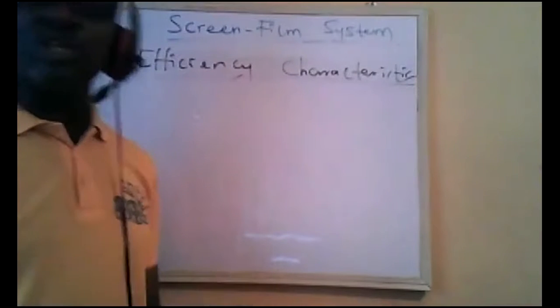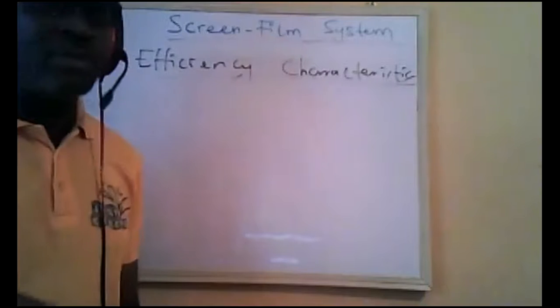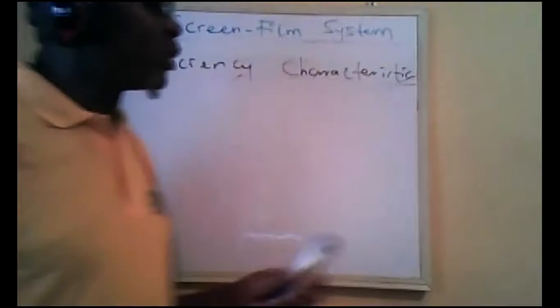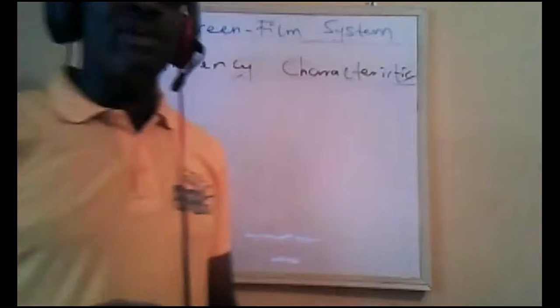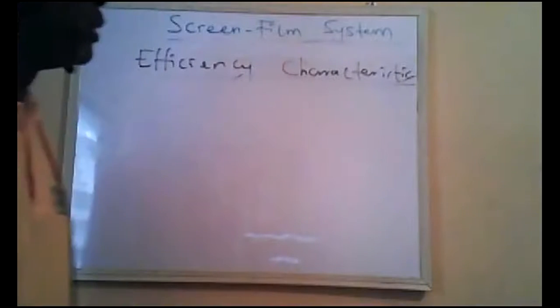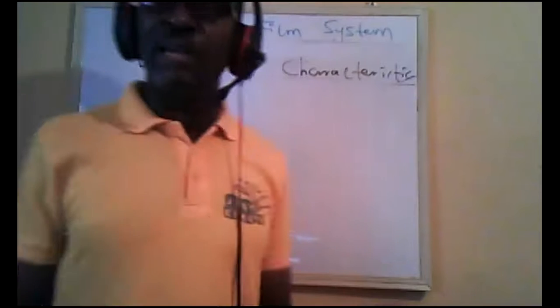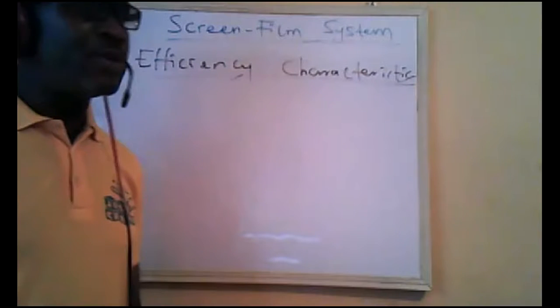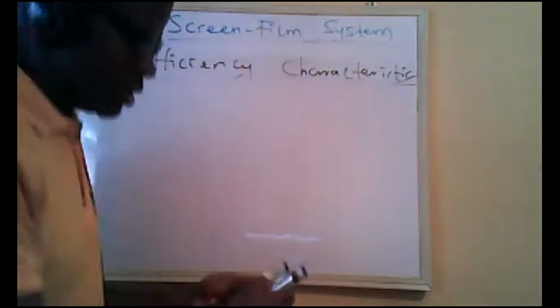the film. You have two emulsion layers, then you have the film in between. So you can actually turn it upside down and it performs the same function. That's the whole reason for that. Then in some modalities like mammography, we don't use a double screen. We use a single screen, for reasons that we will get to know very soon.